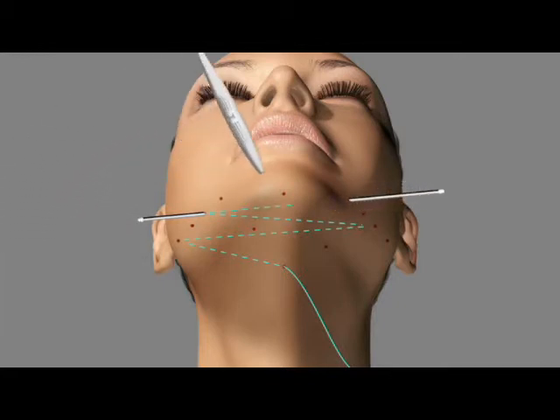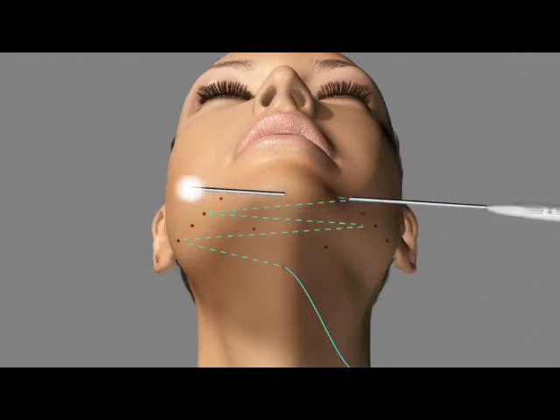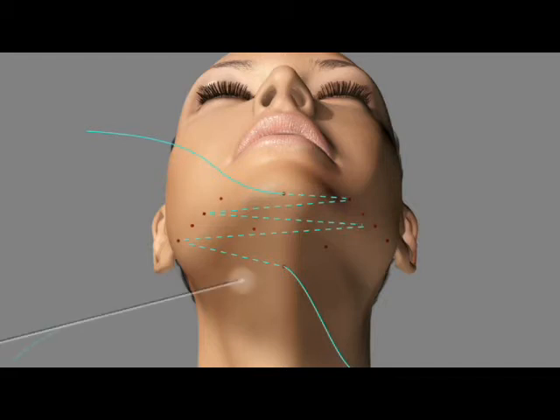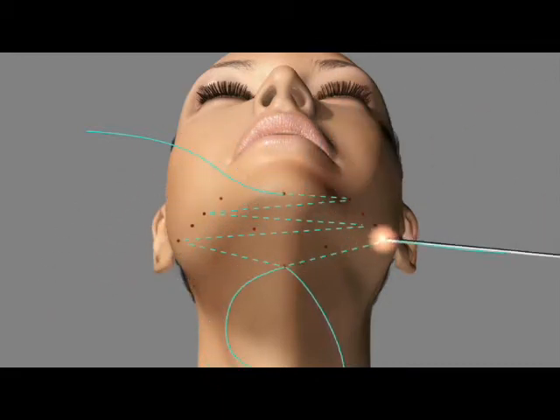It's important to note that with each passage of the rod underneath the jawline, if there's any difficulty, it is okay to puncture and make a new pivot point underneath the jawline. The rod was designed to be straight and should not be bent during this procedure. Therefore, if multiple pivot points are needed to travel around the curved surface of the jawline, they are necessary and will allow the easy placement of the suture matrix.